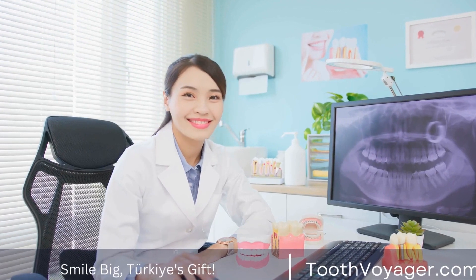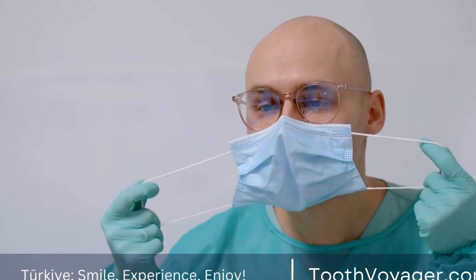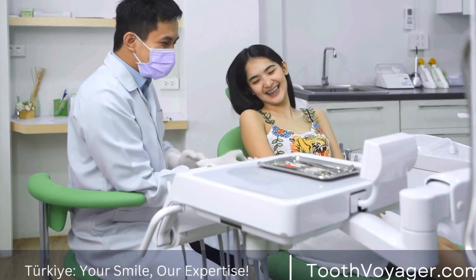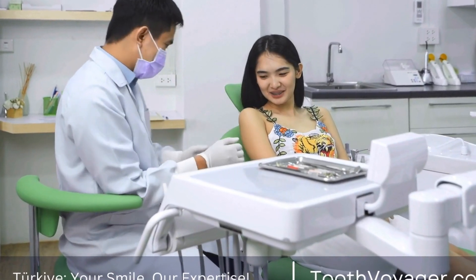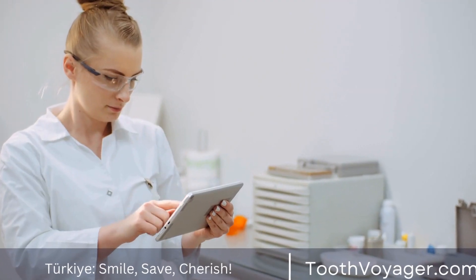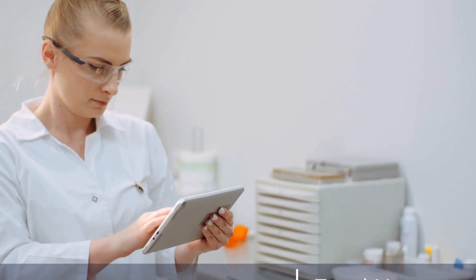Before the veneers can be placed, the dentist will need to prepare the patient's teeth. This may involve removing a small amount of enamel from the front surface of the teeth to make room for the veneers. The dentist will then use a special bonding agent to attach the veneers to the teeth, creating a strong bond that will hold them in place.